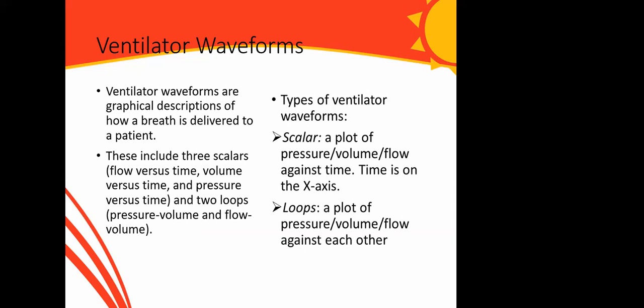Does it make sense? Yes, it does, Chief. Thank you very much. That means that our IE ratio, instead of 1 to 2, we can actually do maybe 1 to 3. Yes, 1 to 3. You give more time for expiration, but not that you are increasing pressure at expiration. The increased pressure at expiration is to improve oxygenation. Thank you very much, Chief.